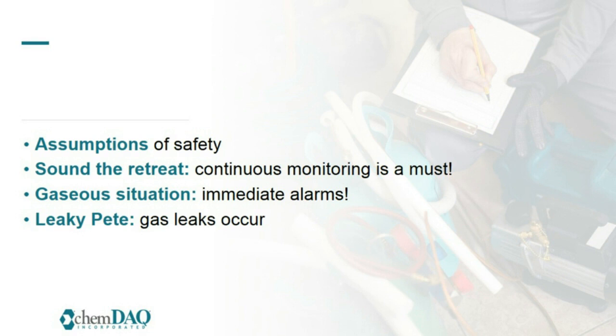These sterilizers can and do break down and malfunction. It's very important that you're performing your daily and your weekly preventative maintenance on these machines to make sure that they continue operating the way that they should. And it's really interesting when you go on to think about it. I put down sound the retreat. Continuous monitoring is a must.